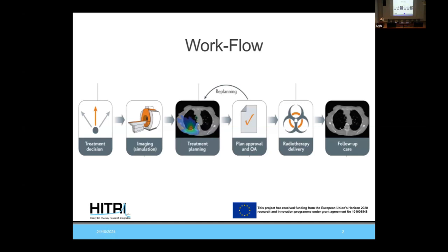Okay, now we're ready. So, this is a typical workflow for a patient who is going to have radiotherapy. First of all, there is the treatment decision, the imaging simulation, the CT, the treatment plan, the QA, the plan approval.